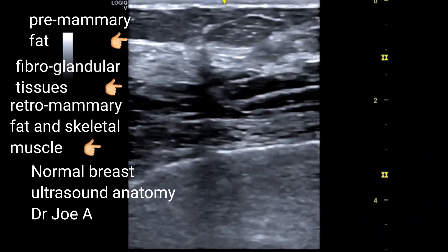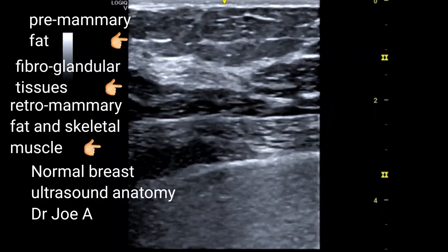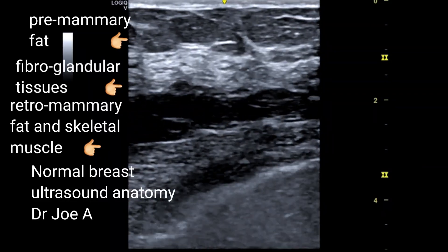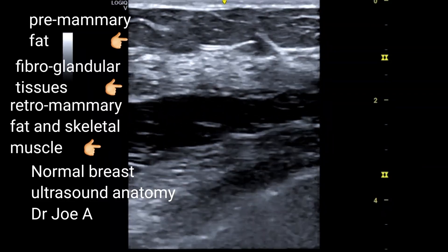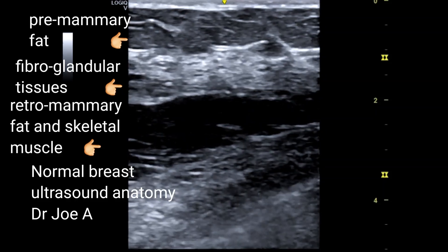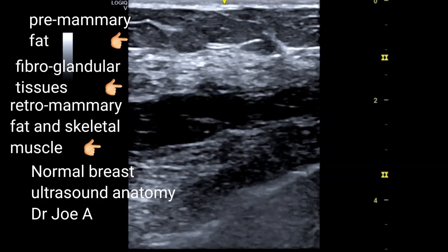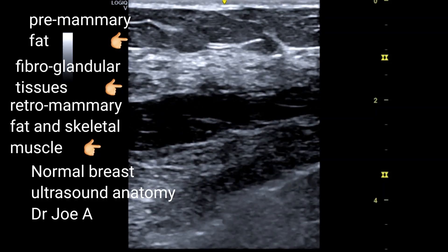Still deeper or posterior is a thin retromammary fat layer, which is darker or hypoechoic. Beneath that is the chest skeletal muscle, seen as hypoechoic with multiple linear stripes.